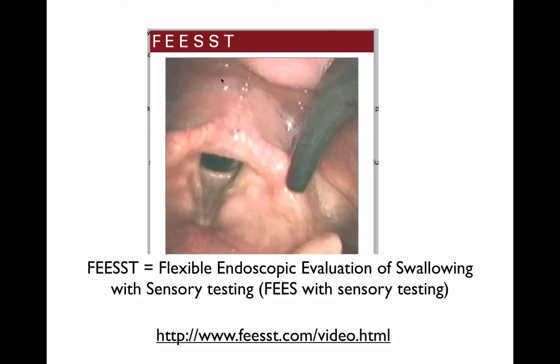One is you can see that there is mucus in the general region of the laryngeal vestibule and fairly close to the vocal folds. And what this means is that it's a good thing that we use that blue food coloring or blue dye when we're doing swallowing assessments, so we can be assured that something is a food substance as opposed to the body's own secretions.